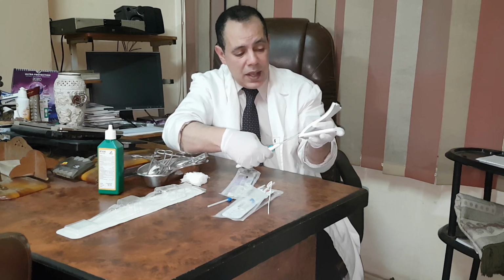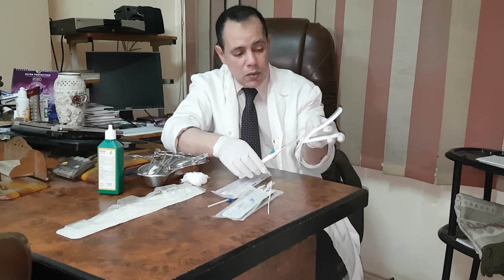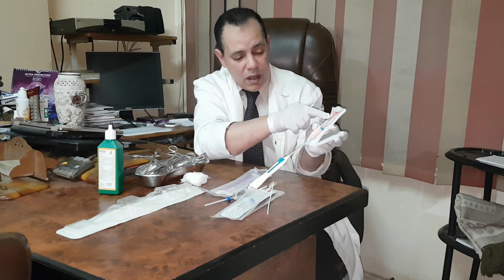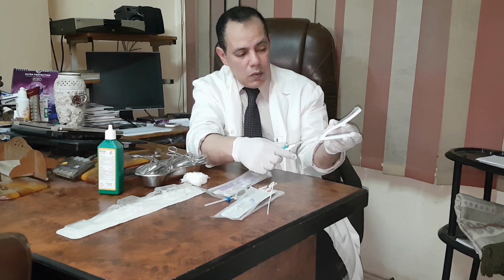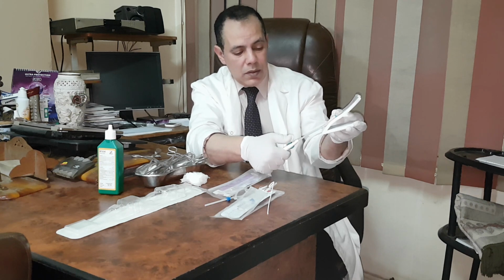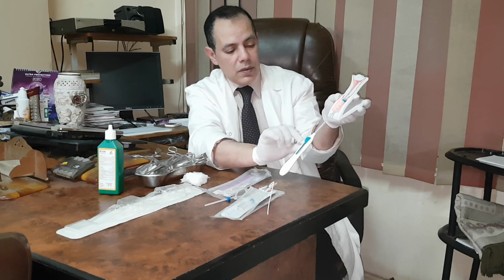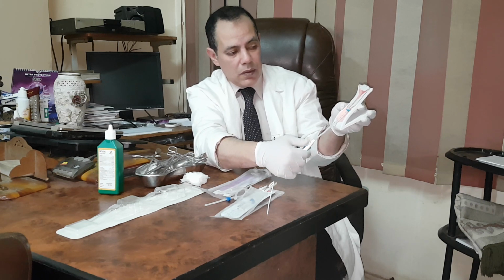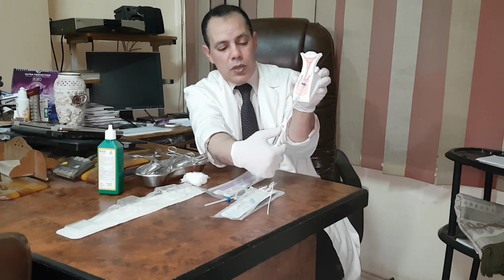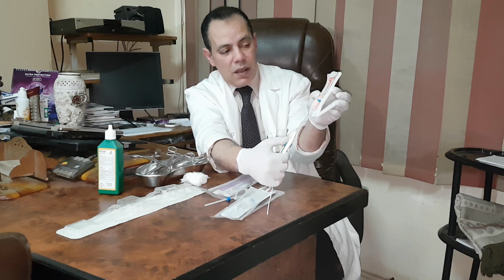Of course, you measure the flange. The flange should be in the proper position from the start because you measured the uterine cavity. So the flange will be at the external os like that. Now the IUD is inside. A little bit of withdrawal. Then, first, push the slider to the first mark here. As you see here, when I push the slider down to the first mark, the IUD is released inside the uterine cavity.